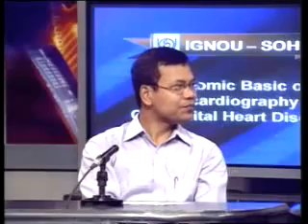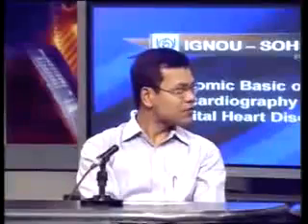Then you come to the AV valve level. I will tell the sequential analysis after this. At the level of the AV valves, this is the mitral valve, this is the tricuspid valve. You have to define which is which, since the AV valve goes with the ventricle. Mitral is connected to LV, tricuspid is connected to RV. Whenever there is discordance, the tricuspid will become the left-sided valve and the mitral will become the right-sided valve. So it goes with the ventricle.